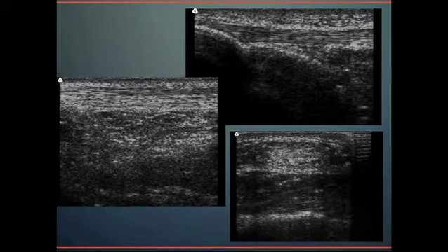This is 3 different regions where we see some tendons. Here's a tendon along here. It exudes that anisotropy, or this false hypoechoic area here, and it's very hyperechoic along here. Note the striations. We can see here in the short axis, this tendon appears quite hyperechoic, and then we move it into the long axis, we can see those striations march across the screen again.